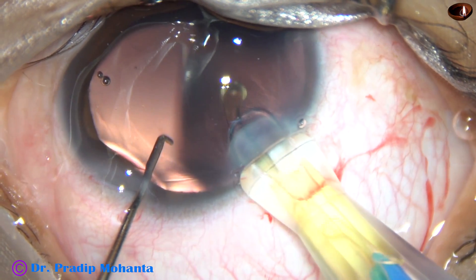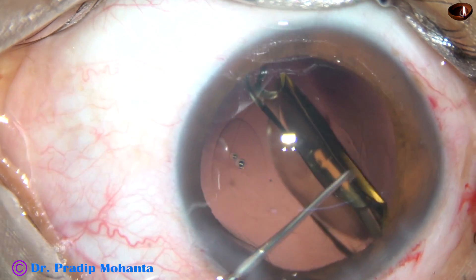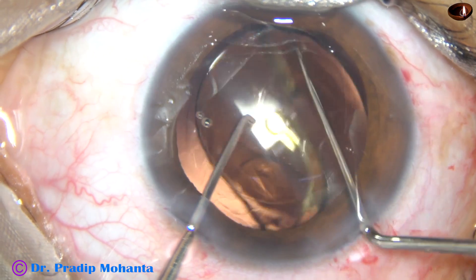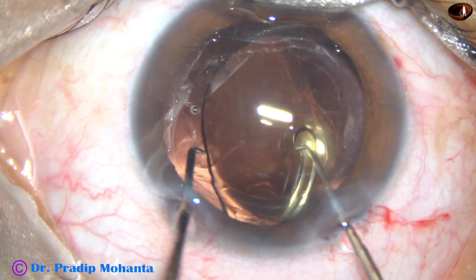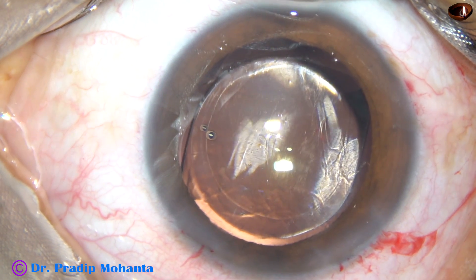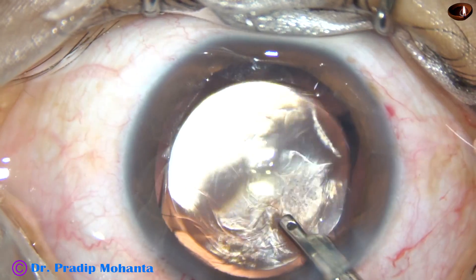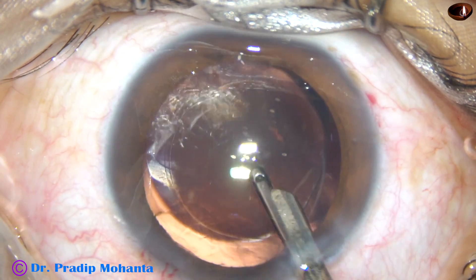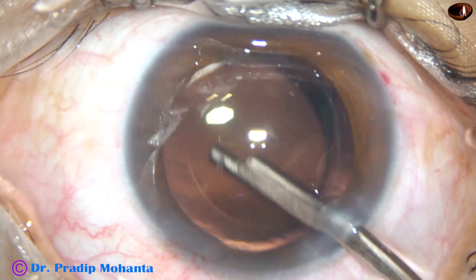The leading haptic goes in first, and the trailing haptic is folded. You can place the trailing haptic with the left-hand instrument. Now rotate the lens — both haptics should be in the capsular bag. The trailing haptic goes into the equatorial part of the capsular bag, and now the lens is nicely placed. The optic is nicely covered all around by the anterior capsular rim, which is very desirable for proper centration. The lens will never tilt if a small rim of the intraocular lens is covered by the anterior capsular rim.